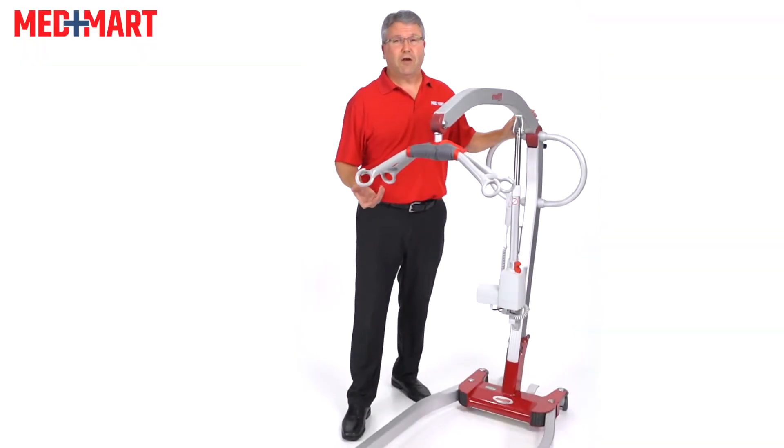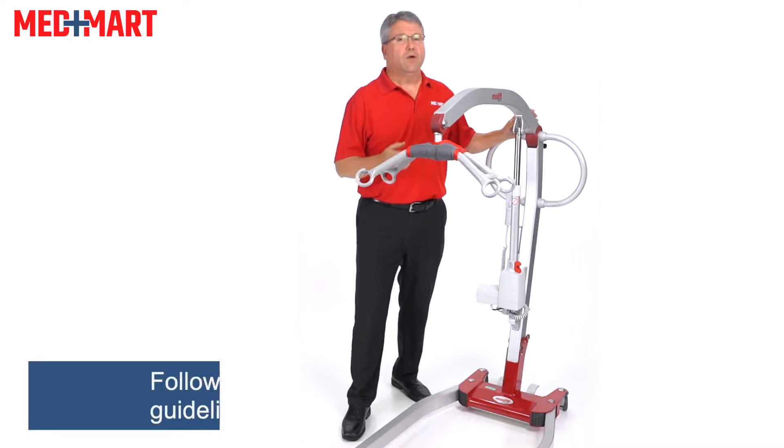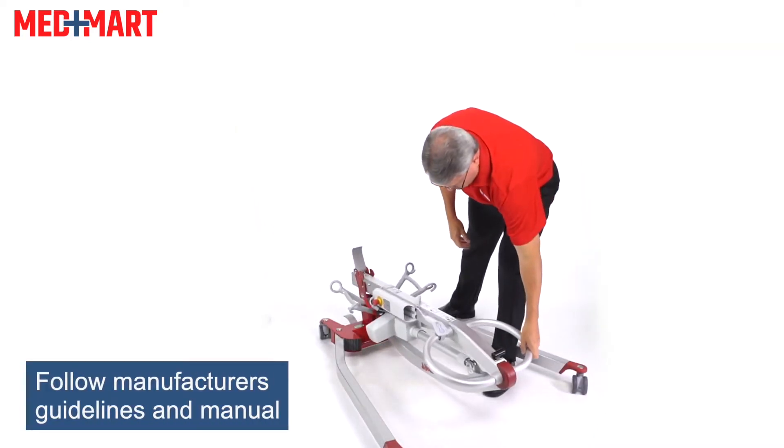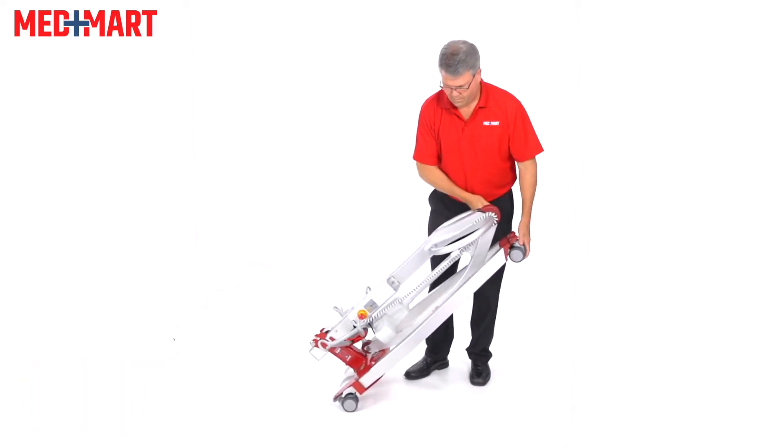If you're in a situation where you have to take care of a patient or a loved one every day using a patient lift, wouldn't it be nice to have a lift that is ultra lightweight, super easy to fold, easy to break down, and easy to travel with?